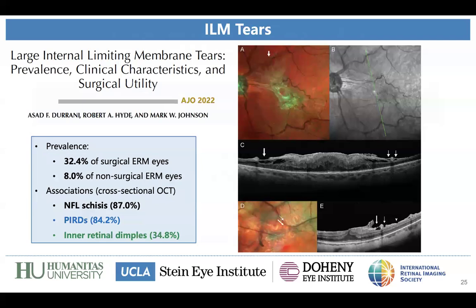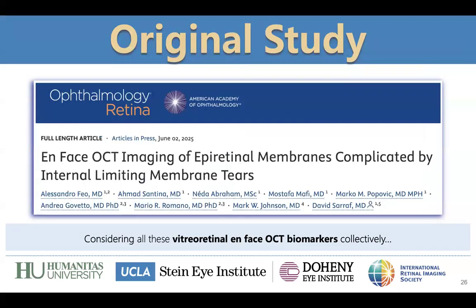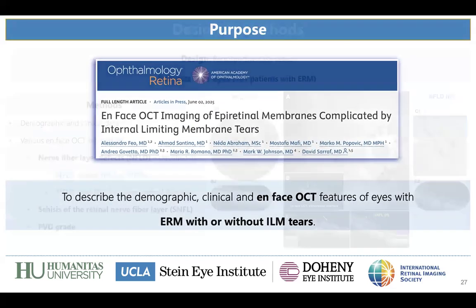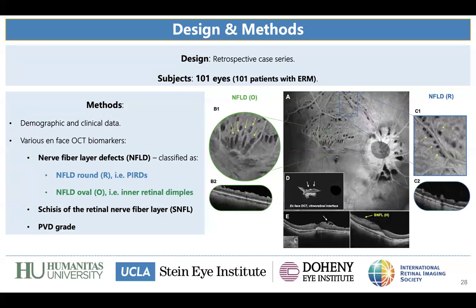For these reasons, considering all these vitreoretinal en face OCT biomarkers collectively and together, we designed this study to employ wide-field en face OCT for the first time and to study epiretinal membranes complicated by the presence of ILM tears. We included 101 eyes from 101 patients with epiretinal membrane.